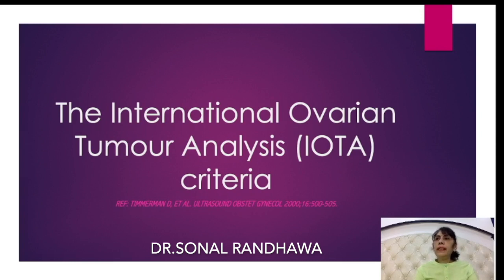Now remember one thing, you don't need to apply this criteria all the time. There are certain conditions when we get a little confused whether this mass is malignant or benign, and there are no typical features as such. In those cases you can make use of this, especially if you are new. With experience, gradually you will come to know what this ovarian mass is. But when you are new, you will often get confused about what kind of mass this is. Is it malignant, or is it benign? What should I write? In those cases, this criteria can help you.